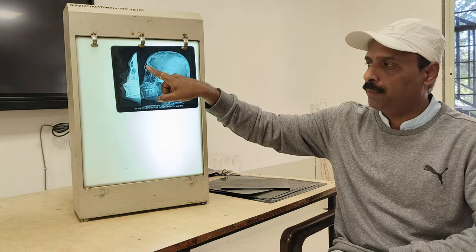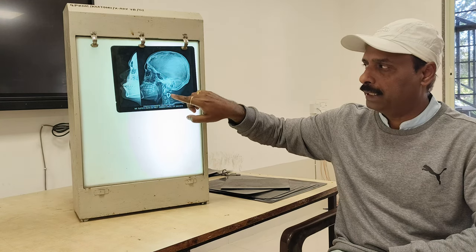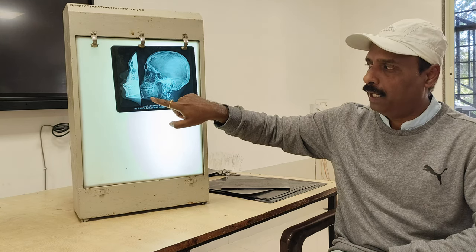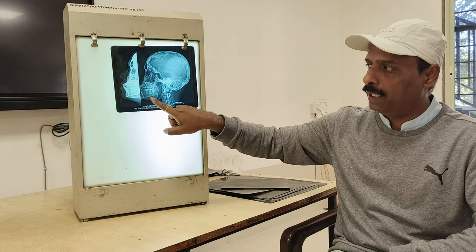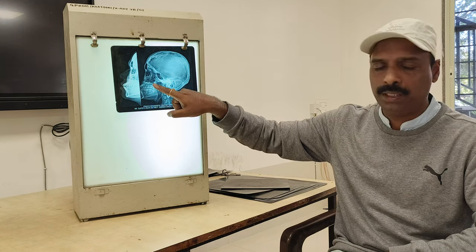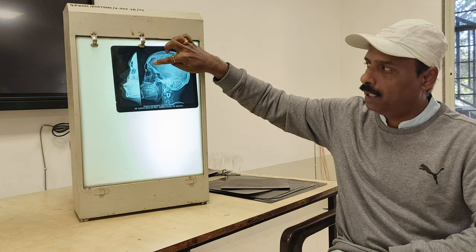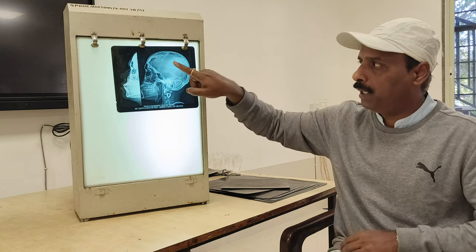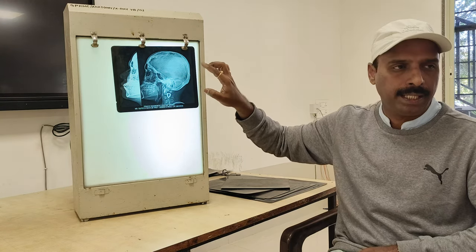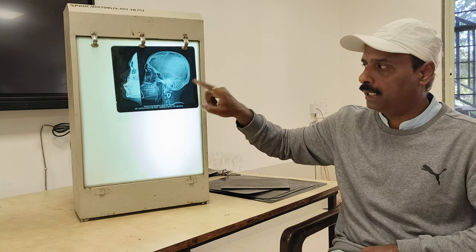Here we can see the frontal sinus, and we have the maxillary sinuses. Then we have the maxilla and mandible. So we get the mandible, the lower jaw, and the upper jaw, which is the maxilla, the nasal bone, the frontal sinuses also, and we have the cranium. Inside, we are going to have the brain. That is the outermost part, which you have to mention: the cranium.